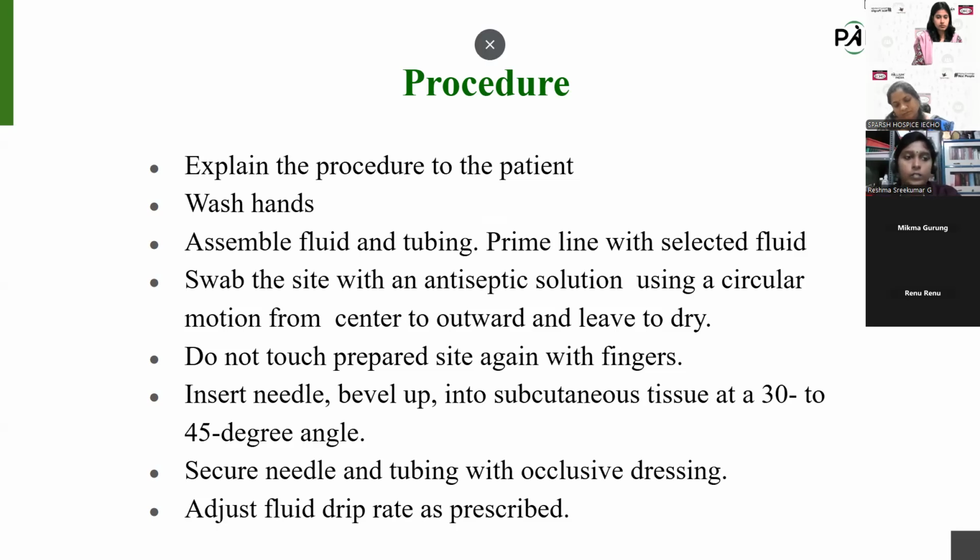The main points we should keep in mind is we should explain the procedure to the patient, why we are choosing subcutaneous site for medicine administration or infusion. And before inserting the subcutaneous line, we should prime the line with selected fluid. And throughout the procedure, we should maintain an aseptic technique during insertion and all. Otherwise, it will cause infection or inflammation to that area.